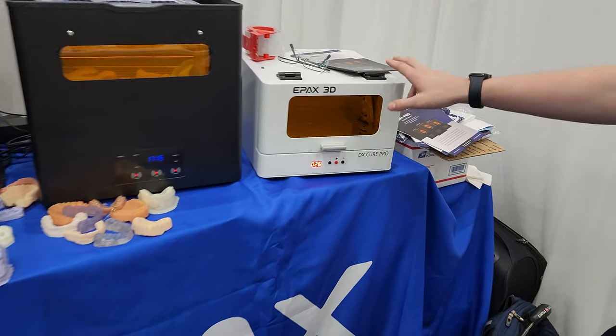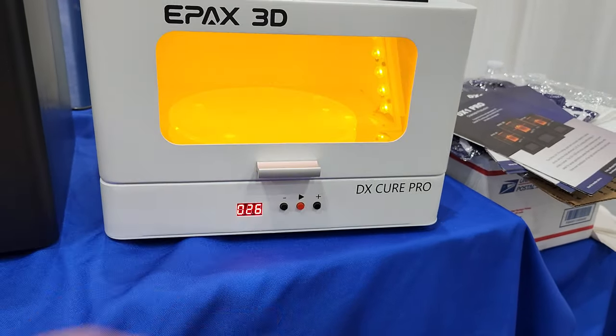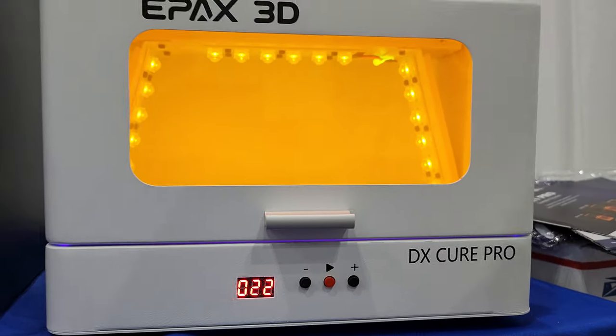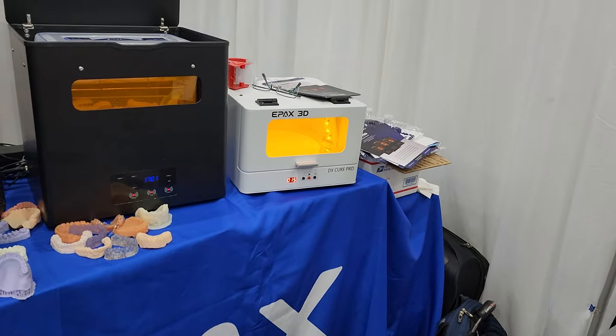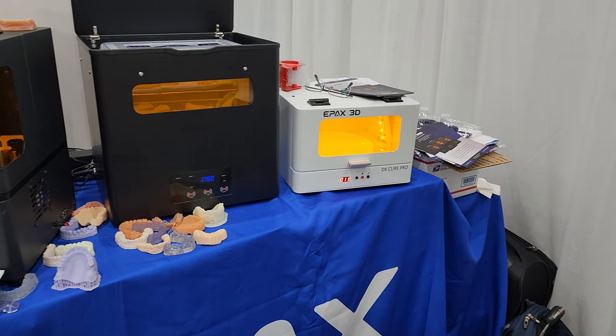After that you put it into this cure machine right here. This cure machine works similar to a microwave but with UV light. It rotates the models around and reflects light from all angles so they can cure in all places and cure through the material to get to the insides. It does it in a little bit less than a minute depending on the material.